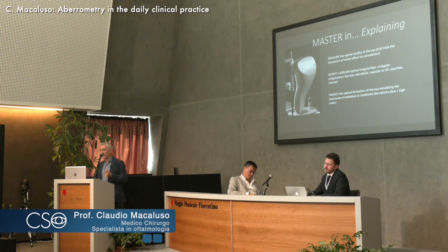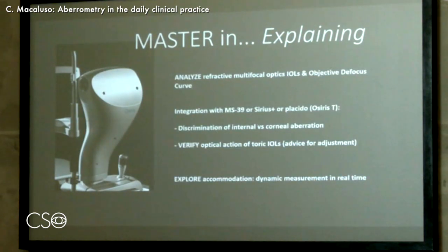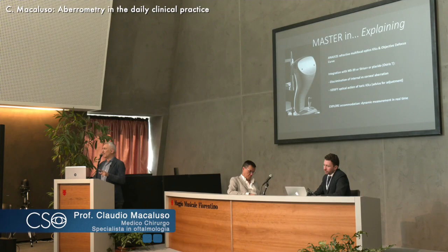We can also predict the optical behavior of the eye, simulating what happens when we take away components from the sum of the aberrations. We can split the correction. We can also analyze something new and very useful, and I think Francesco is going to talk about this later in the IOL session, but I will anticipate it a little.